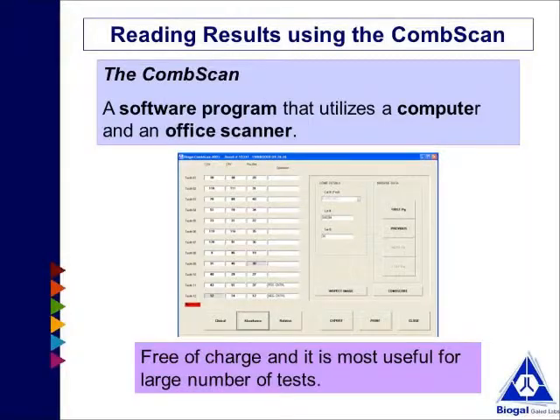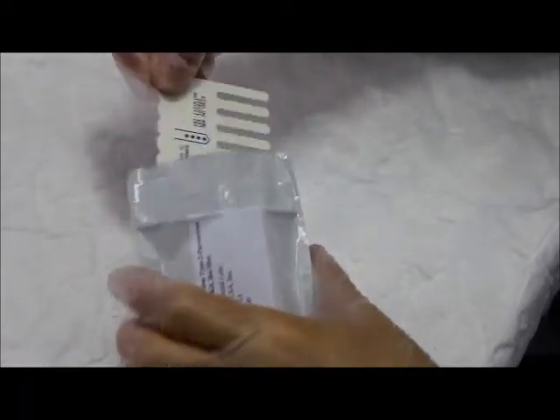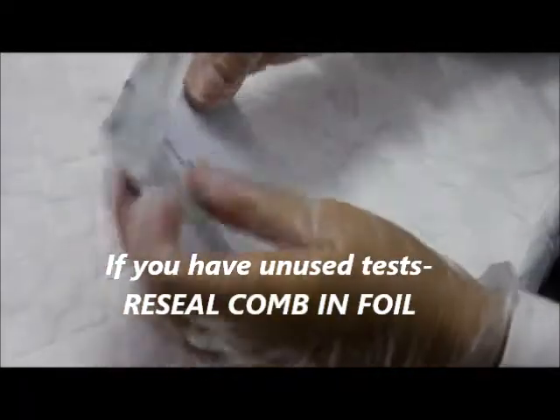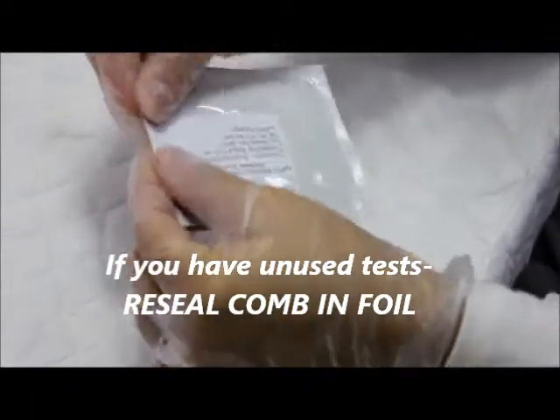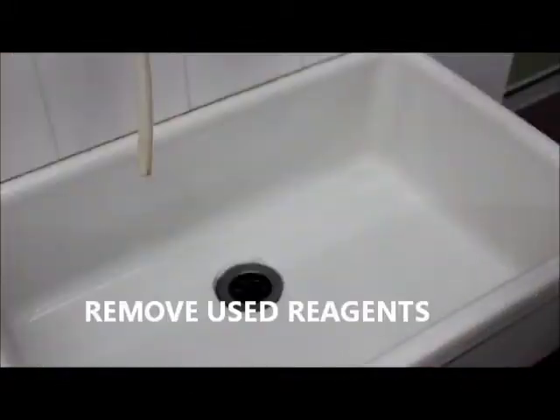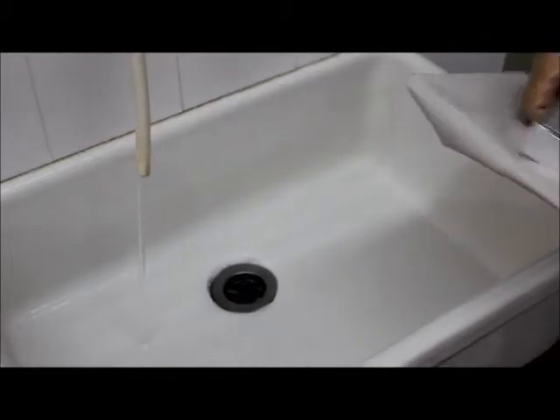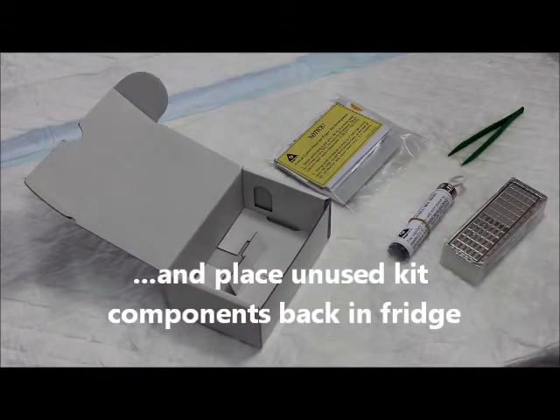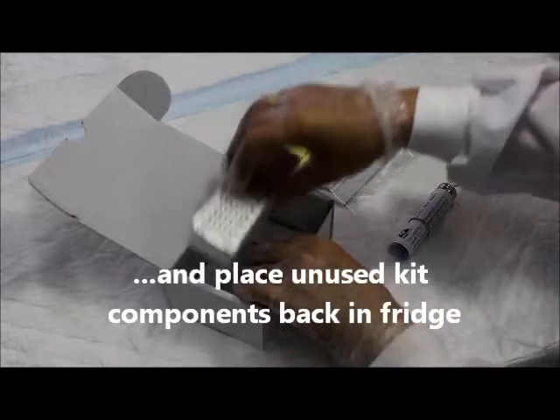Another way to read the results is by using the ComScan. This is a software program that utilizes a computer and a compatible scanner. This should only be used when very large volumes of tests are interpreted. Note that this interpretation is specific for the Immunicomb canine VaxiCheck antibody test kit. If you are using a different Immunicomb pet test kit, check the interpretation specific to that kit.